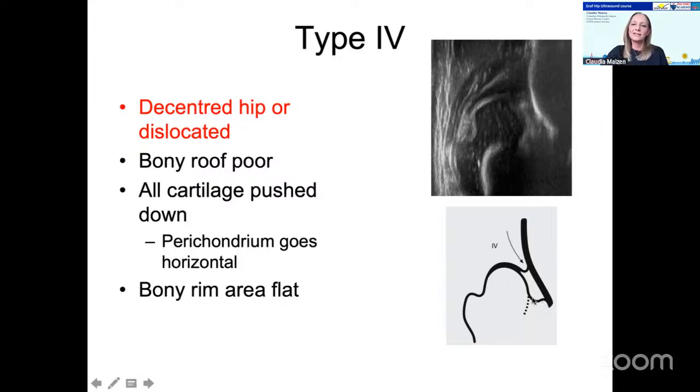So what you're actually excising, or what we have incised, was the growth plate of the acetabulum. So this down here is not the labrum. It is still above here at the end of our cartilaginous roof. And what we have down here, preventing the femoral head from reduction, is actually part of our cartilaginous roof.